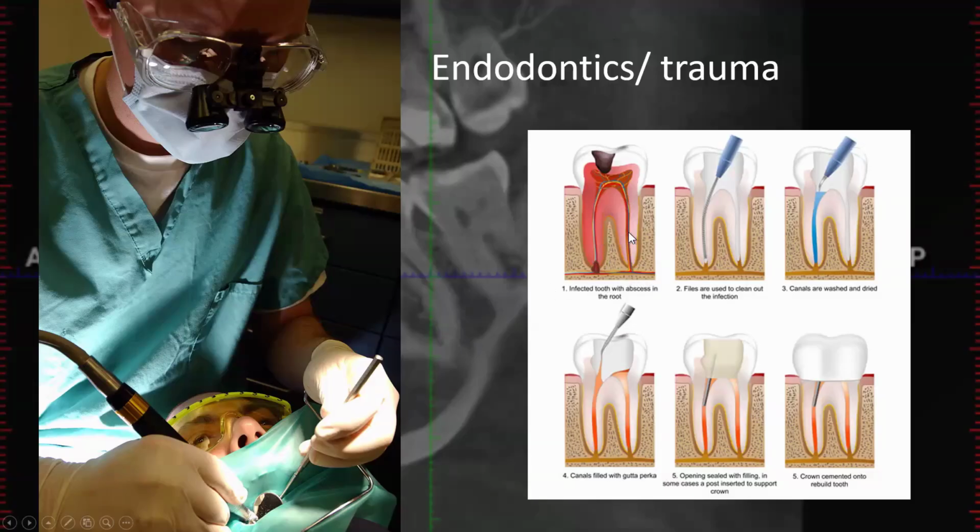But it is great for looking at the anatomy of the canals. That's why most endodontists at least have access to it. Endodontists get the difficult cases, right? These teeth with 4 canals, 5 canals maybe, and they're winding in different directions. Maybe a lot of pulp stones that they've got to drill through. And so it's a huge advantage to them to be able to see that before they go into the tooth and be able to plan and expect what they're seeing.